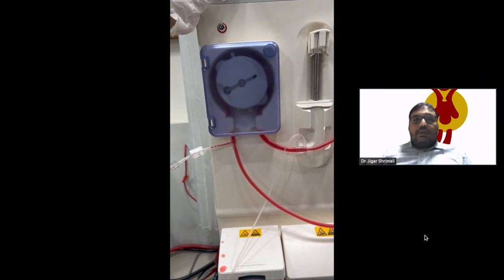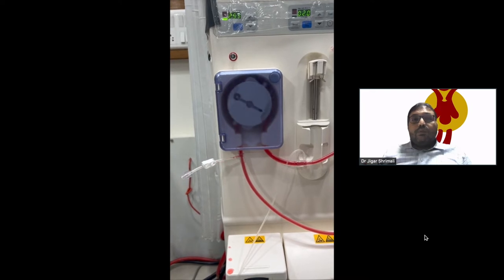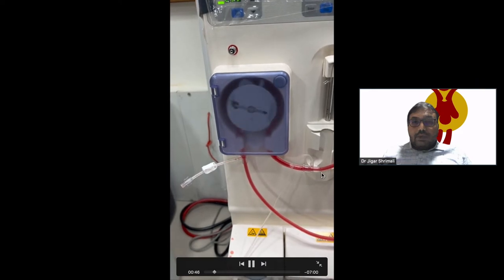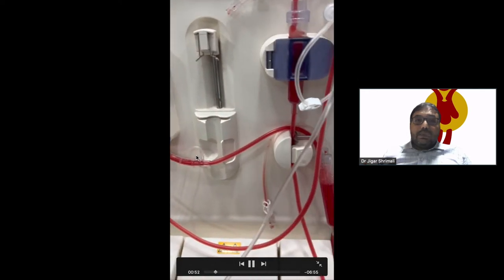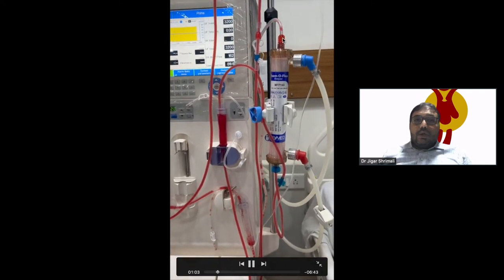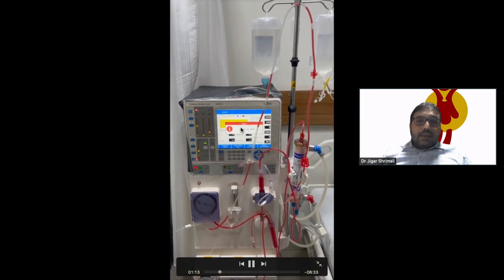The infusion set — where it was connected — was disconnected, and the clamp was opened. Initially, the air entered. The air entered the circuit.